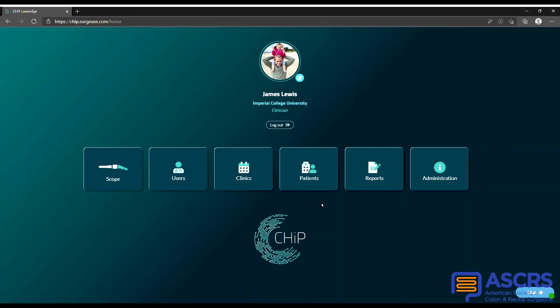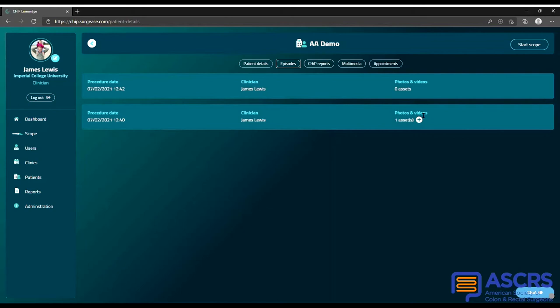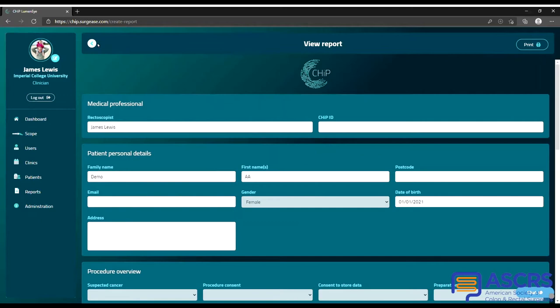Patient records are accessed from the patients tab. Within each patient's record you can access previous encounters with images and videos immediately available for review. Reports are completed on a standard template which can then be printed or emailed as needed. Once you are within the patient environment, you can easily start a new scope session.